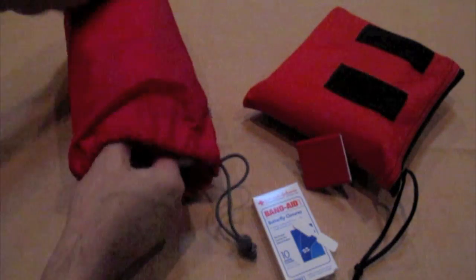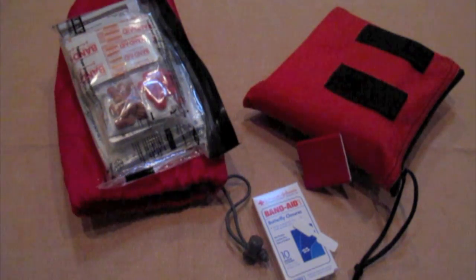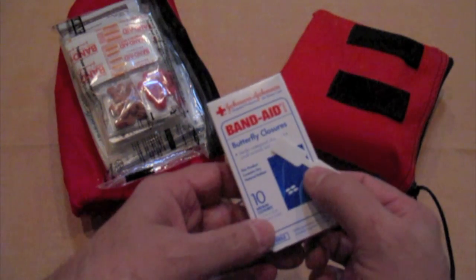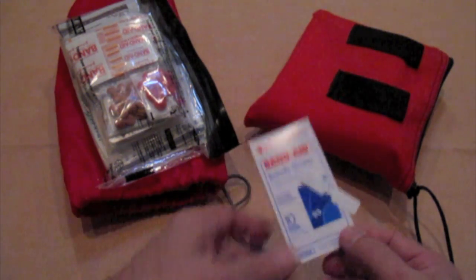Whether it's supplies from your level 1 first aid kit or perhaps a bit of duct tape from your survival ready pack. Let's talk about options for field expedient butterfly closures. Let's talk about the basic concept here.